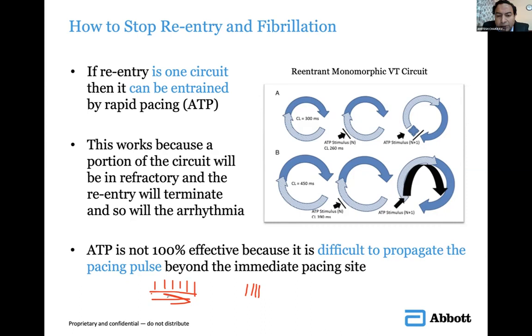Yes. So this has come up now in circumstances where the patient is not willing for an endocardial placement. There are defibrillators available which you can wear, where they are a bit annoying sometimes. But again, you have to understand that the impedance of the chest wall needs to be taken care of. So they are more specific for an individual.